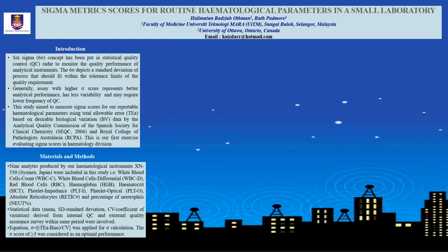We have selected one batch of QC-check XN-L from Sysmex Corporation, which included all QC levels, and have tabulated the data to calculate the statistical indices such as mean, standard deviation, and coefficient of variation for all the selected analytes. The QC materials were run twice daily, and QC acceptance was based on our quality assurance procedure.